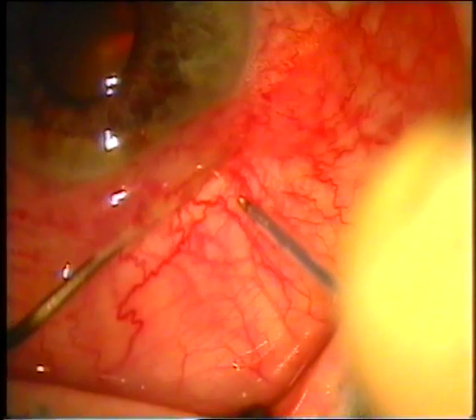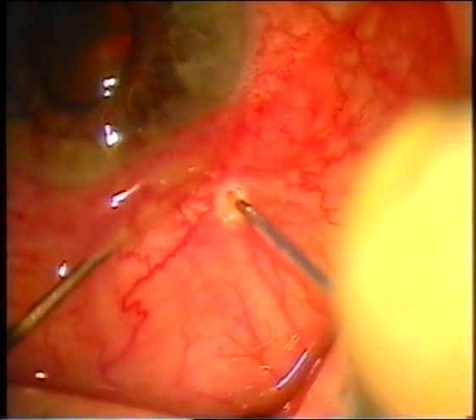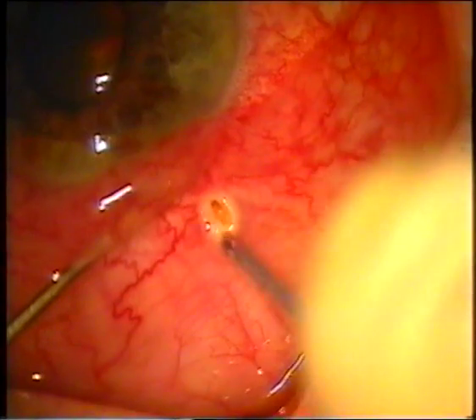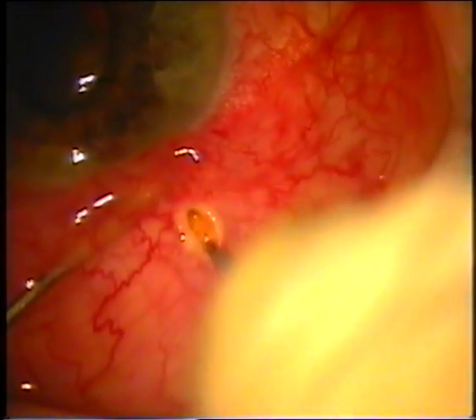As happened in this case, we used a 300-micron fugo blade tip. We entered the conjunctiva and as can be seen there is a thermal burn, which most likely was due to insufficient dispersal of liquid under the conjunctiva.